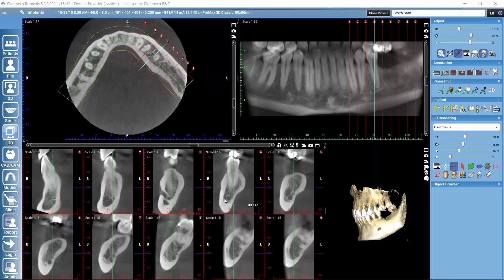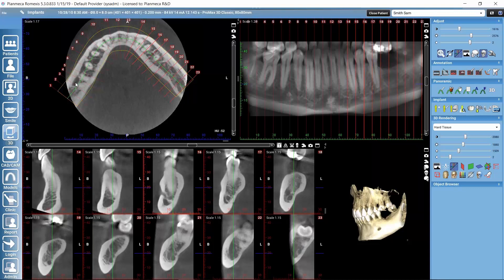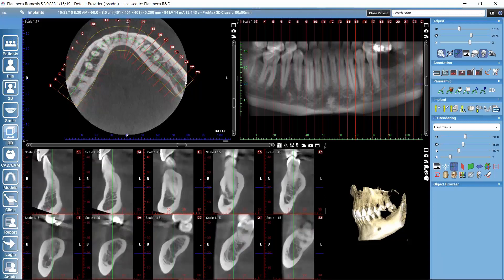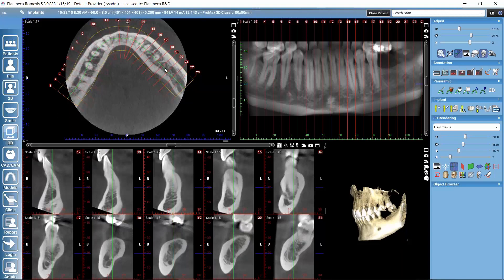Let's look at a couple of other viewing modes for cross-sectional slices. There are controls here that we don't usually have for other slice views. The first is the 'Full Arch Mode,' which generates cross-sectional slices at specific intervals throughout the whole dental arch. This way I can examine the whole dental arch with slices always at specific intervals relative to each other, and I can make measurements on the slices.